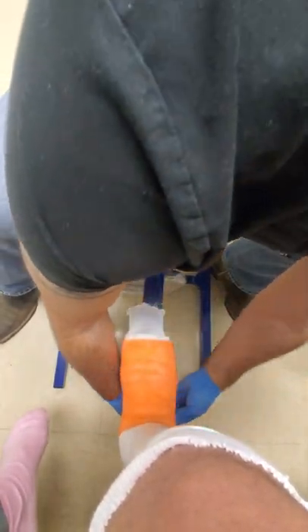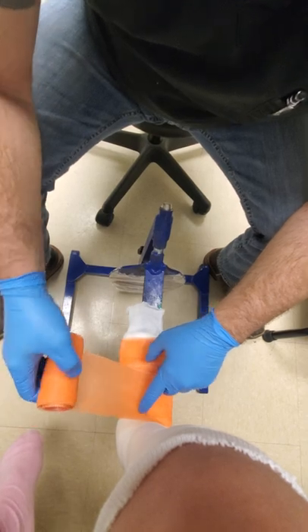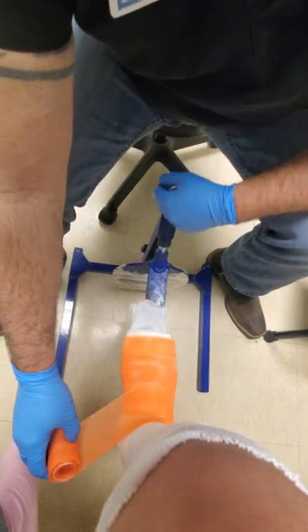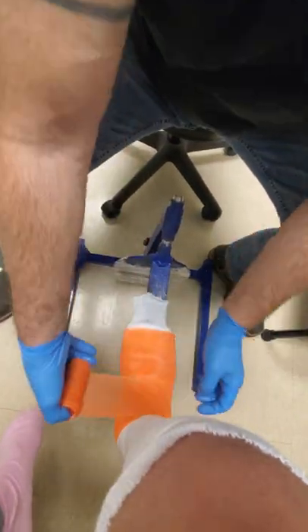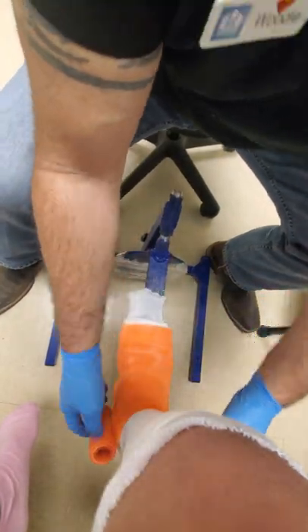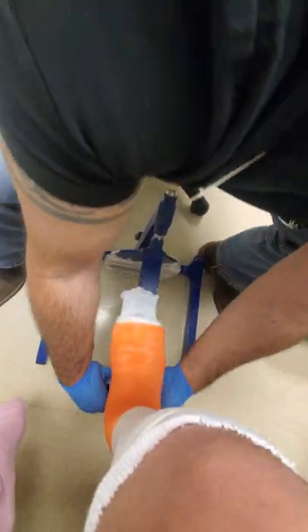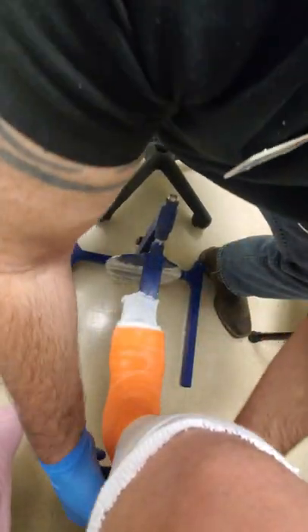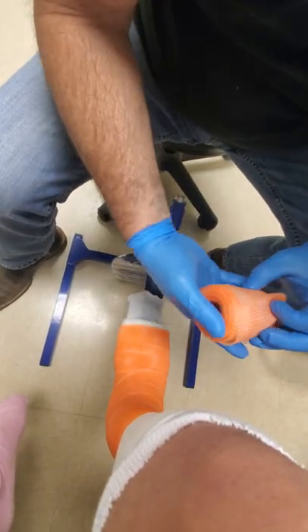Since we're doing a demo, I want to point out something I did here that I wouldn't usually do or recommend. When coming to the crease, I more favor bringing half of the fiberglass over the crease so it's not digging into them — I think it's just a more comfortable cast. Having worn casts before, I think patients will appreciate it and you'll have fewer people come back with complaints. I'll test the fiberglass to see how rigid it's becoming, and if I have time I'll put the second layer on after the cuffs before creating the bottom mold.